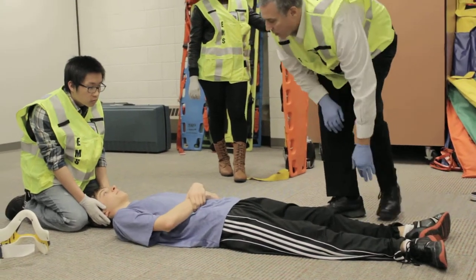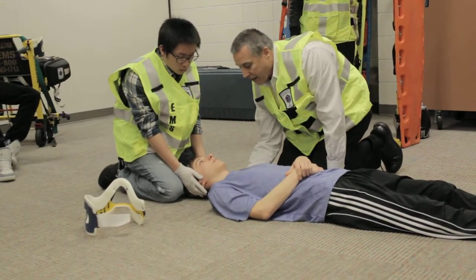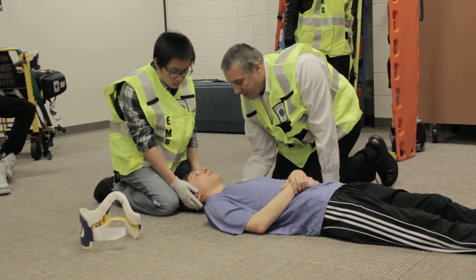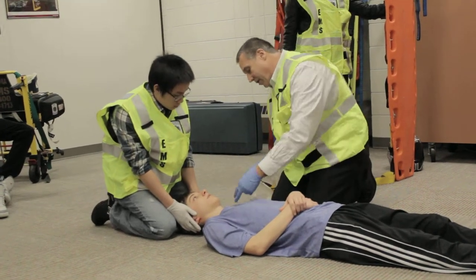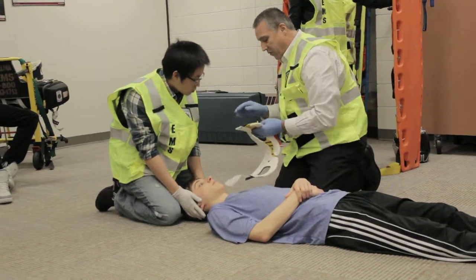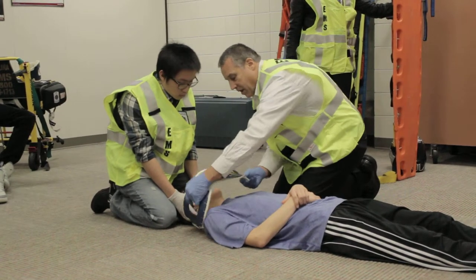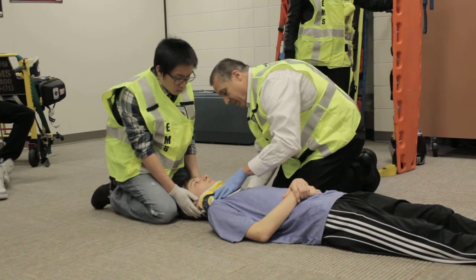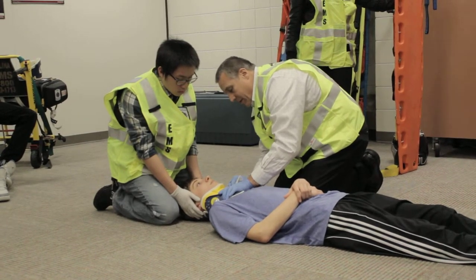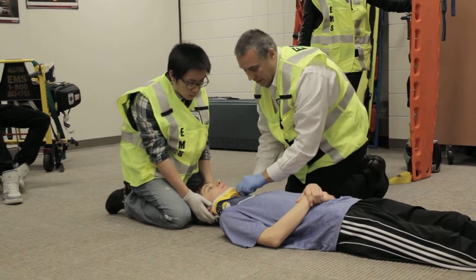Can you feel that? Yes. What am I doing? You're pinching my right foot. Okay, good. I'm going to assess his neck by palpating the back of his neck. Does that hurt? Yes. He tells me that he has cervical spine pain. I'm going to go ahead and measure for a cervical collar, and we're at the right size. Can you breathe okay with that? Yes. Okay, good.